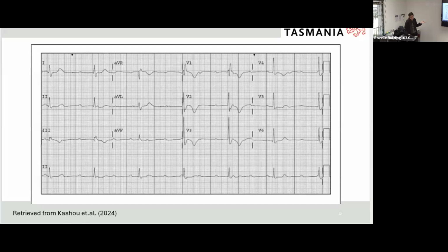So getting on with our 10-step method, the next part that we need to start looking at is our ST segment. So it helped. Okay, amazing, Madeline, great. So in terms of our ST segment, what do we sort of need to look at in terms of that part of our ECG? And is it just one rhythm, one view that we can look at?